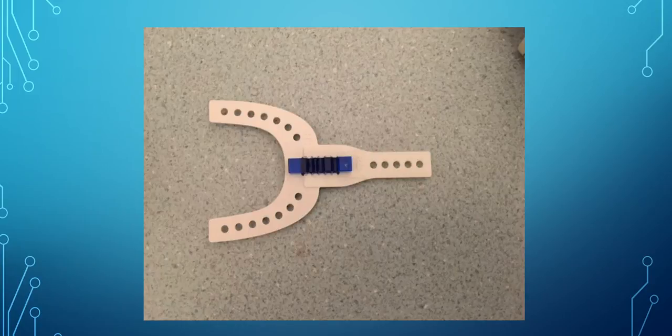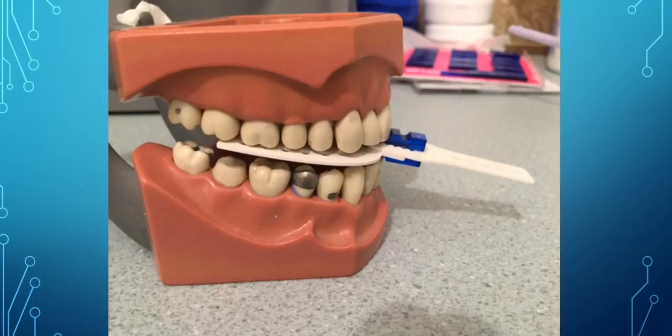You put the fork on there and the handle just like you would for any bite registration that you're taking with the Airway Metrix. You put it into the teeth, having the patient bite into it — in this case, end-to-end. And you can see the fork is inside here along the teeth, along the center groove of the teeth, mandibular maxilla.